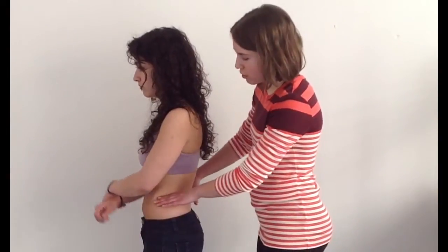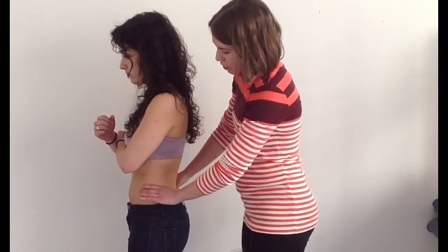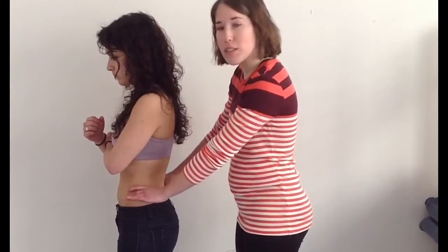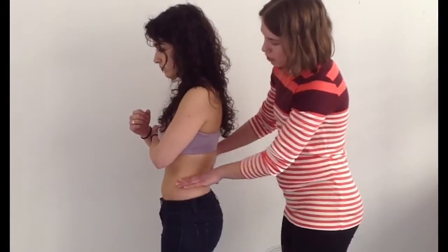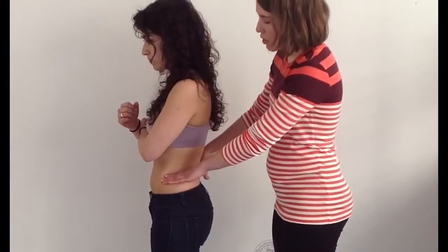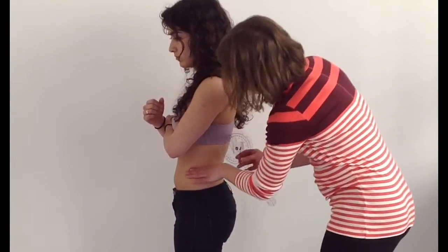Okay, so for landmarks for your goniometer, you're going to want to start by palpating on skin. You're going to palpate the superior iliac crest, and then you're also going to palpate the anterior and posterior iliac spines to find the midline of the pelvis. And so your fulcrum is going to go at the junction of the superior iliac crest and the mid-axillary line, which is going to be about right here.